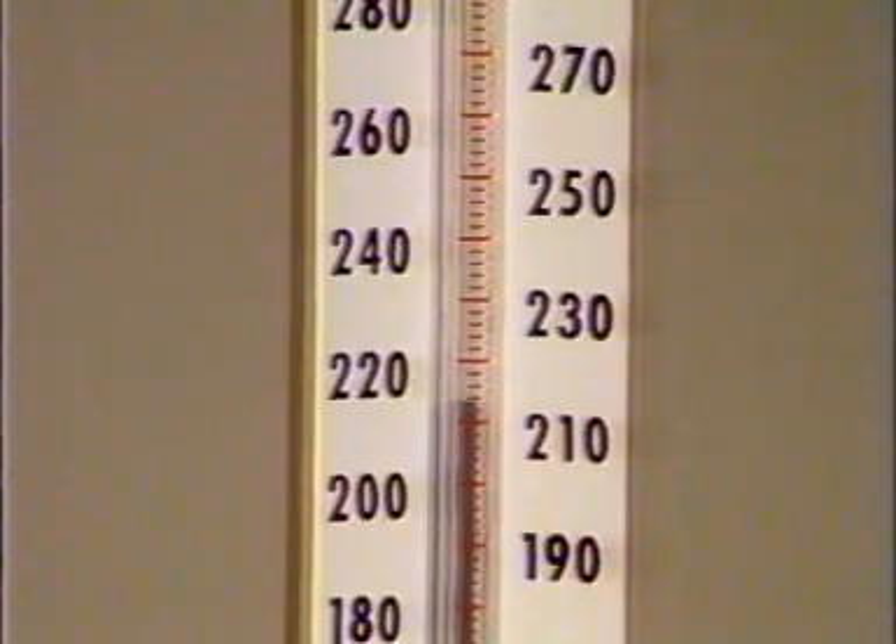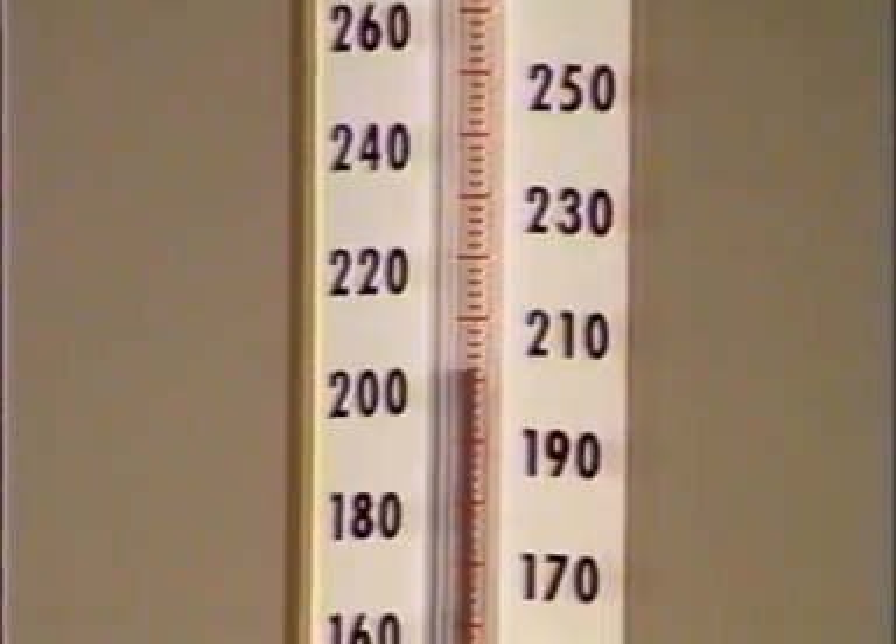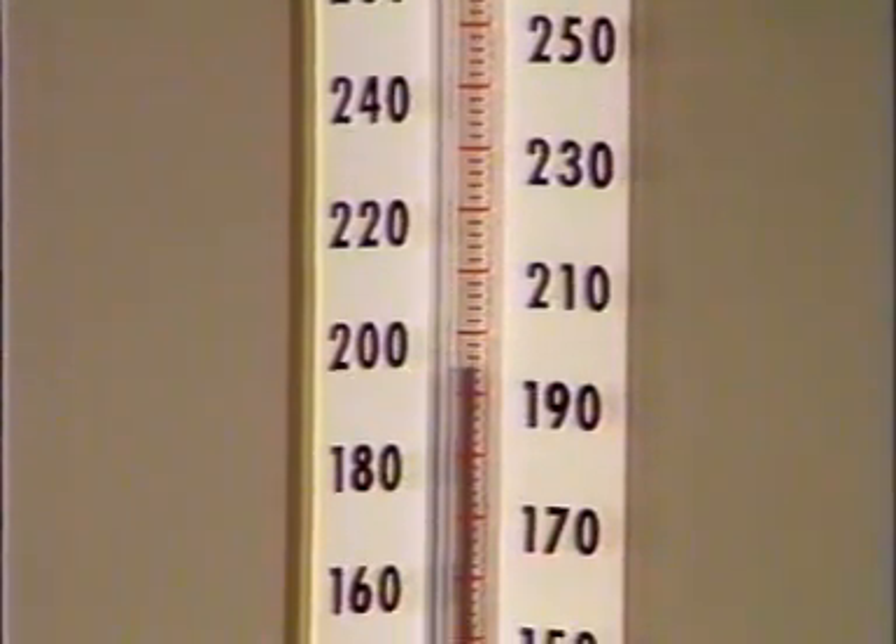The point at which repetitive clear tapping sounds first appear for at least 2 consecutive beats gives the systolic blood pressure. You should hear this now.